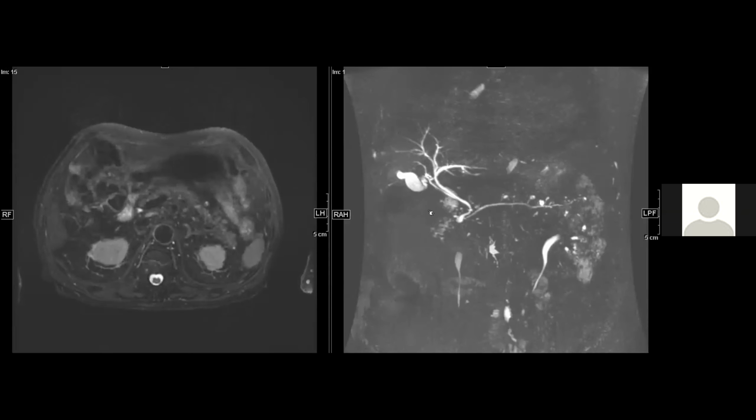Well, once we found this abnormality, I did try to look for the long communication, but in this case there is a divisum. So some form of congenital anomaly. Yeah. Okay, that was my case. Thank you. And that divisum might actually be causing something, because you've got all those dilated side branches there too. Right.